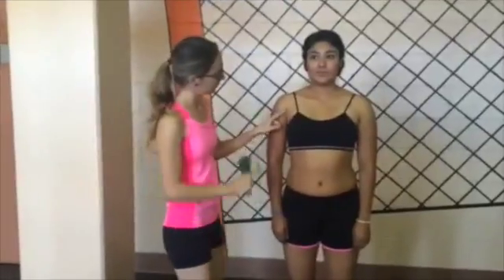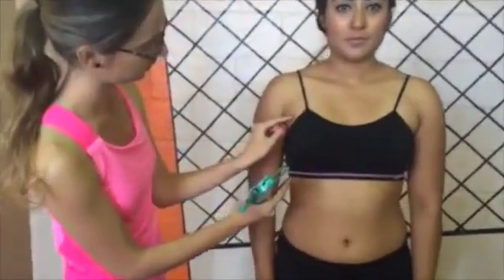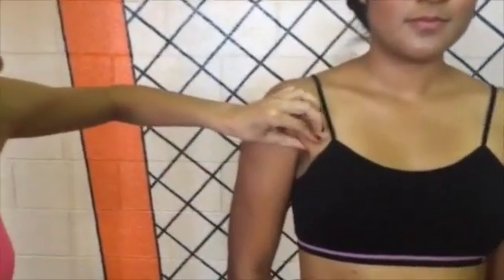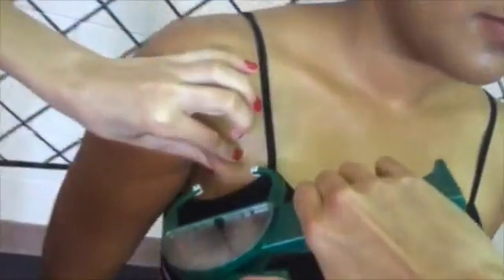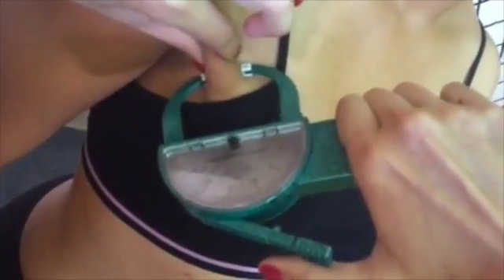Now is the chest pectoral fold. For women, take one-third the distance between the anterior axillary line and the nipple, and take a diagonal fold. For men, it will be halfway that distance.